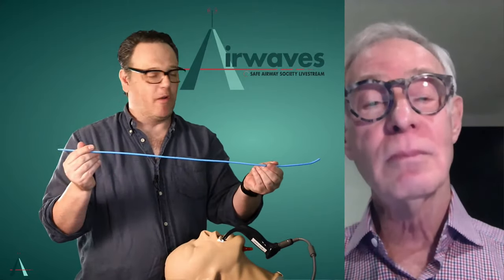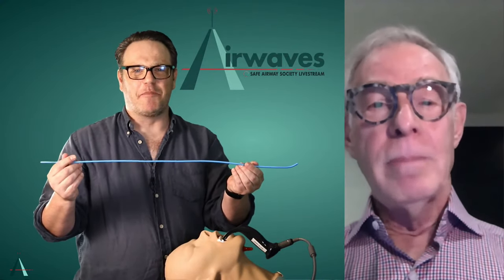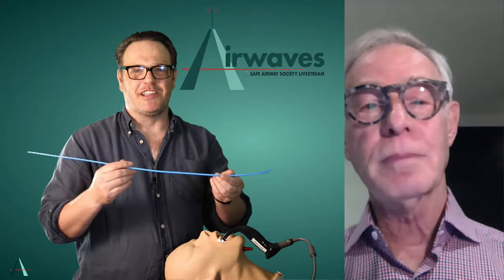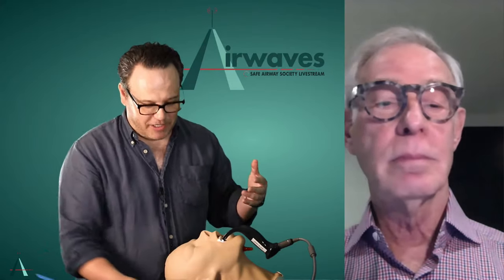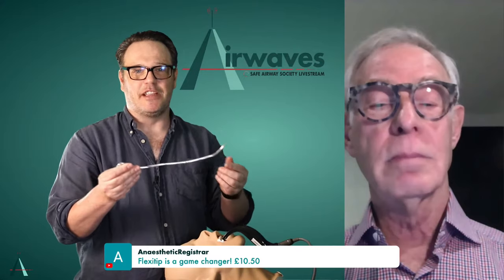Yeah. I have a need for it. And I'm reluctant to say anything negative about the Frova device, because Giulio Frova is one of my closest friends. But I think the point is, we all use this and it's a fantastically useful device, but it's not purpose designed for the hyperangulated blade. I think one of the traps we fall into is trying to MacGyver our existing equipment to fit new stuff. When you can use something like even just a malleable stylet that everyone has access to, it's just much more fit for purpose, isn't it?